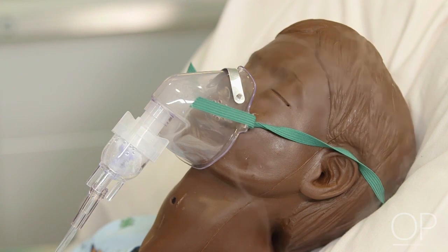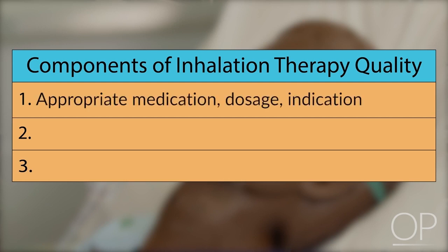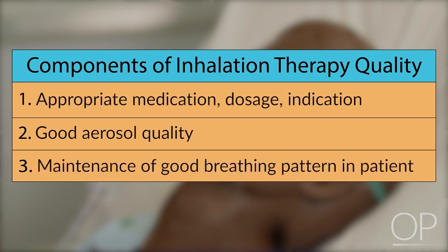Now that the treatment is running, let's discuss inhalation therapy quality. There are 3 main components to quality. 1, the appropriate medication, dosage, and indication for our patient. 2, assurance of good quality aerosol. And 3, maintenance of good, proper breathing pattern in our subject.